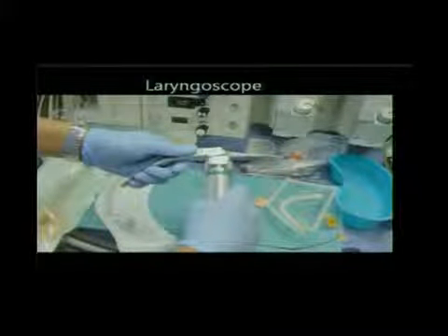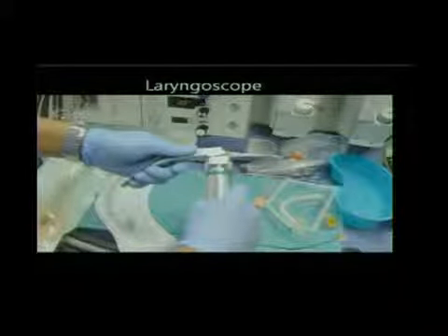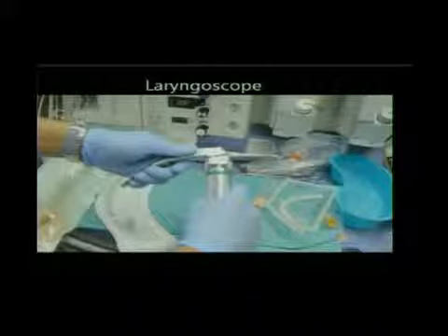And the laryngoscope is what you use in an emergency if you cannot move air into the patient. It's not surprising that we're starting our setup with airway equipment because the single most important aspect of anesthesia ever is continued movement of air into the lungs. That's the most important thing we do, is we move air and oxygen into the lungs.